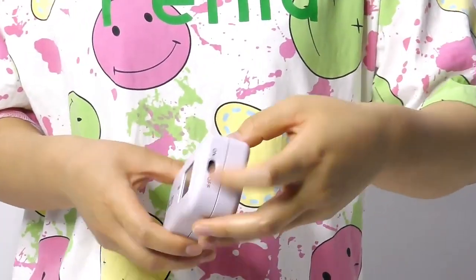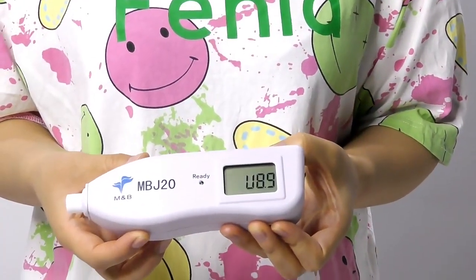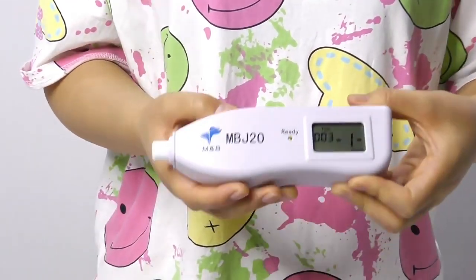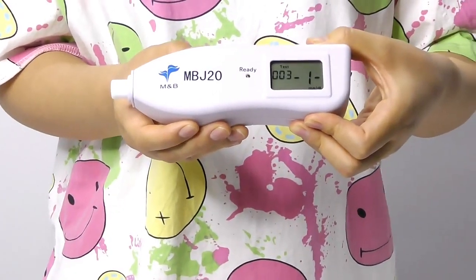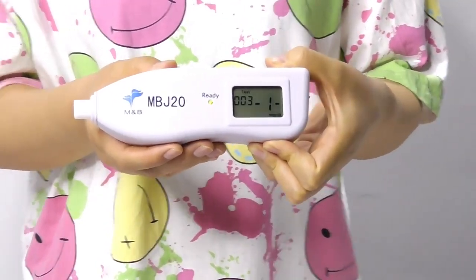Press the on-off button to turn on the equipment, then press the reset button. The ready light turns green, which means the user can test — the device is now in normal test stage.